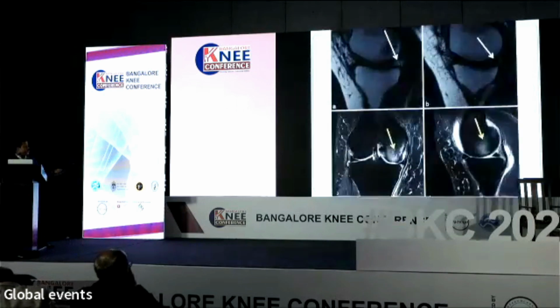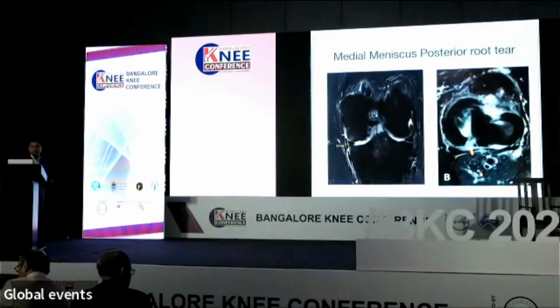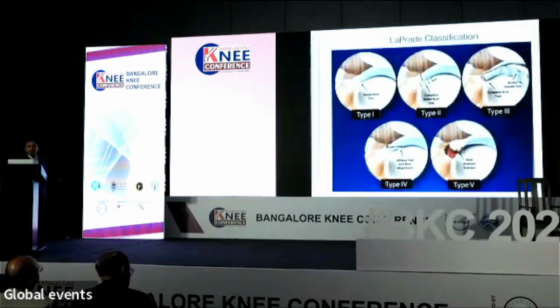So again, apart from the signal changes, you will also see bony contusions in the medial and lateral condyles of the femur and tibia. You can very well make out extrusion of the meniscus if it is more than 3 mm on a coronal view, again classically diagnostic of a root tear.